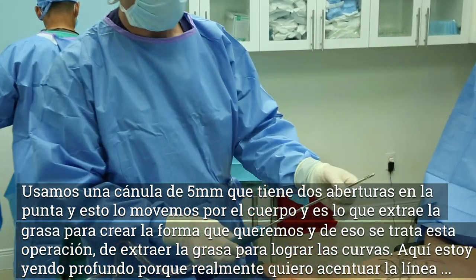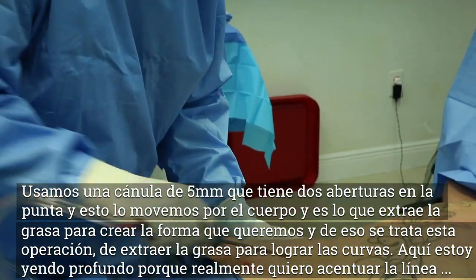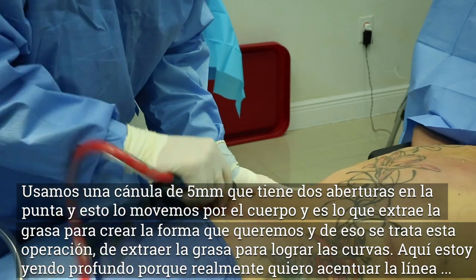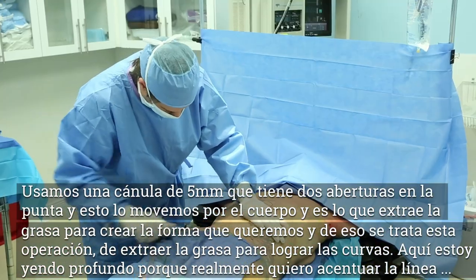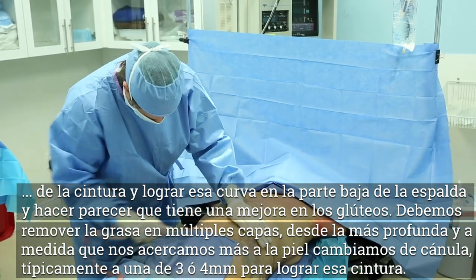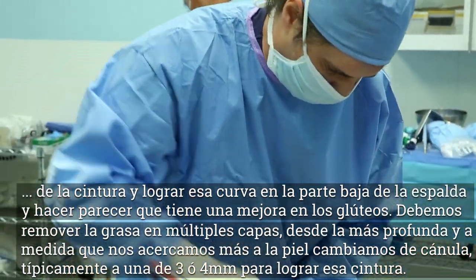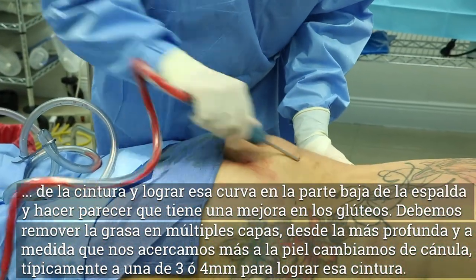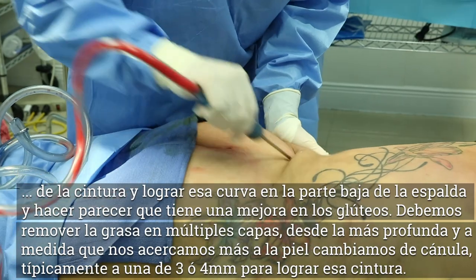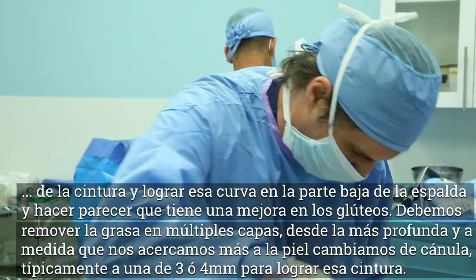What we're doing is using a five-millimeter cannula — the Mercedes tip — we go in and out and this is what sucks the fat out to create the shape. It's about removing the fat to create a certain shape. Here I'm diving down because I really want to get that waistline nice and tiny and really get that curve in the lower back so it looks like she had some enhancement to the buttocks. You have to get the fat out in multiple layers — I start with the deep fat and then as I get closer to the skin I'll go down to a smaller cannula, like a four or three, typically a four.